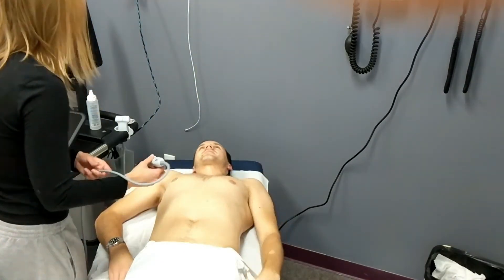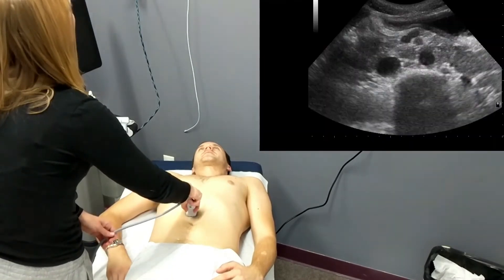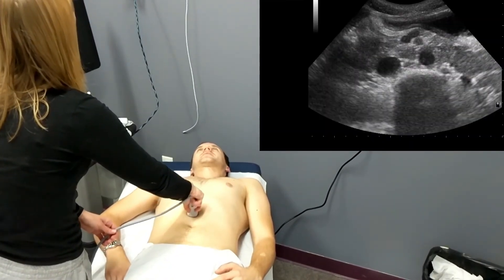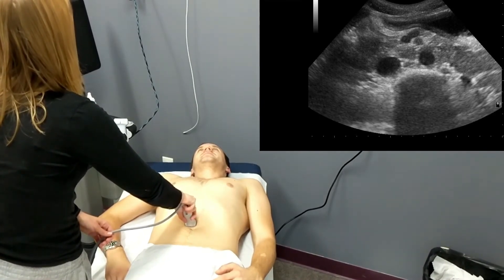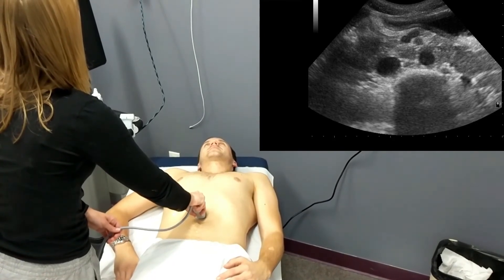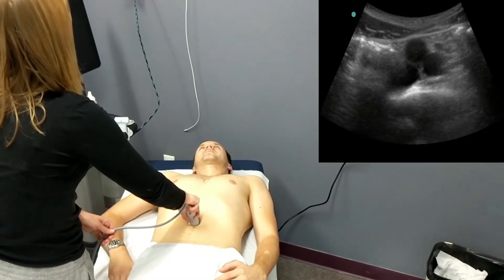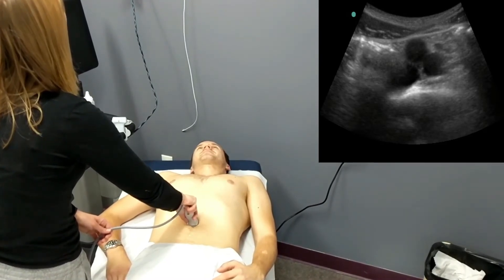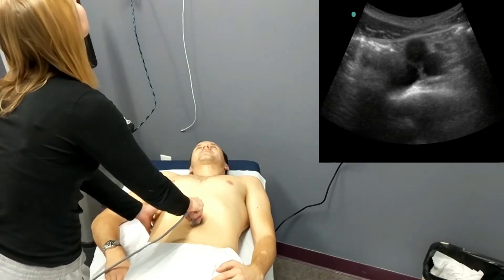Next, our student is going to move on and start examining the abdominal aorta. She needs to compress the transducer with firm enough pressure to displace any overlying loops of bowel. She's looking for the shadow of the spine and the aorta just above it, assessing the abdominal aorta for any aneurysms, moving from the epigastric region all the way down to the iliac bifurcation.